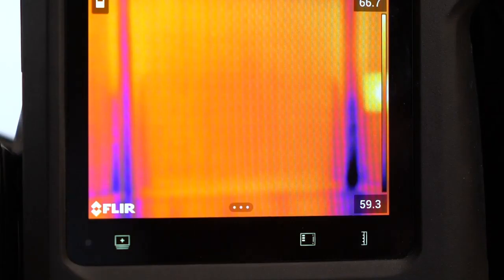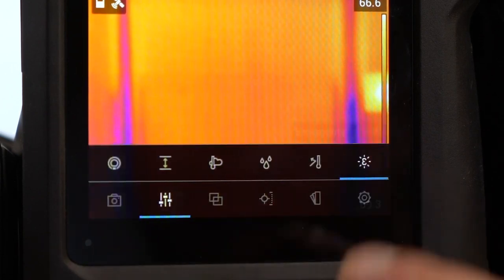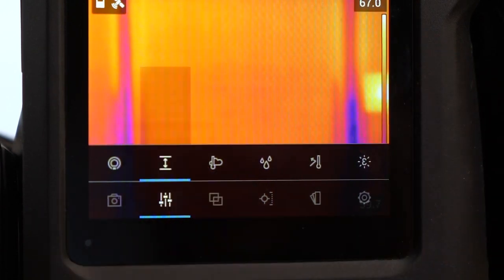First, tap the screen to bring up the menu and select measurement parameters. Set your emissivity to 0.98. Next, set the distance from your camera to your target.